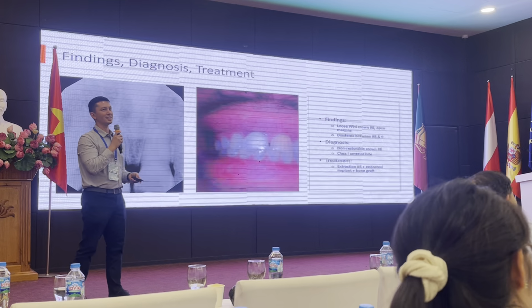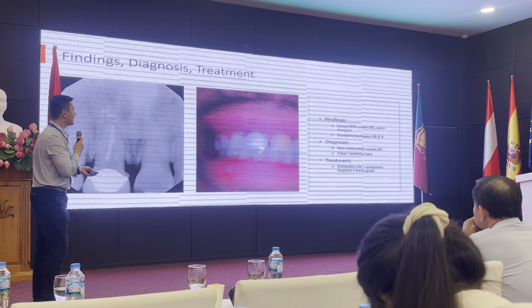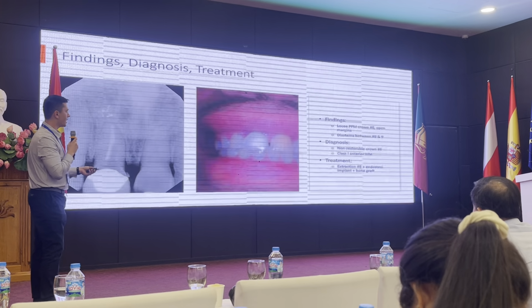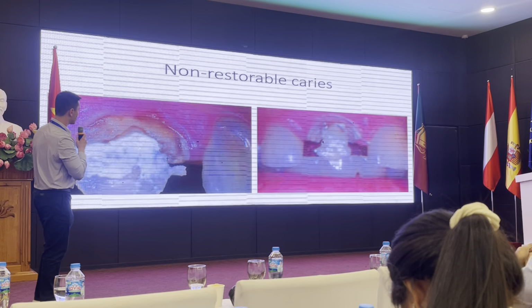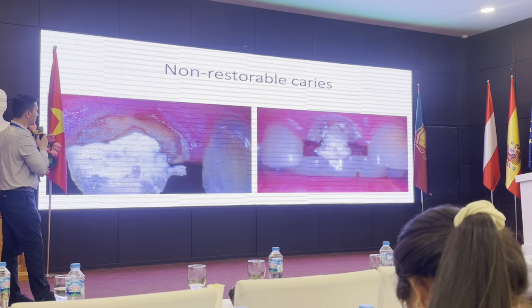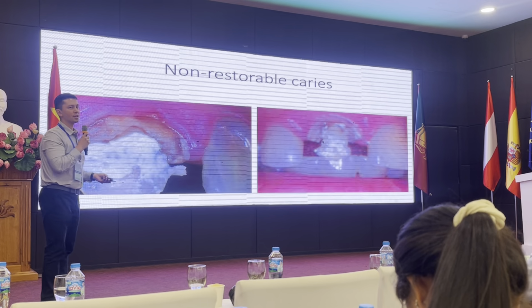With a passion, he hates those removable partial denture flippers, the single tooth flipper. And he's 44, so he wants something more permanent and higher quality, so we're going to give him that. This is what it looks like when you take the crown off. Recurrent decay, this is the lingual view. This is the facial view. And there's just nothing left to restore.